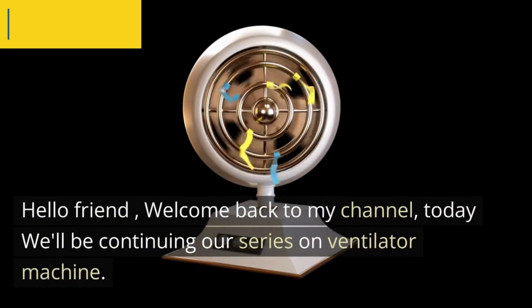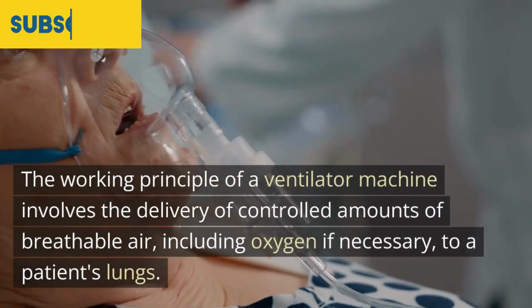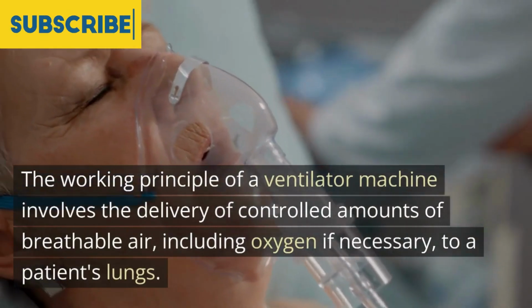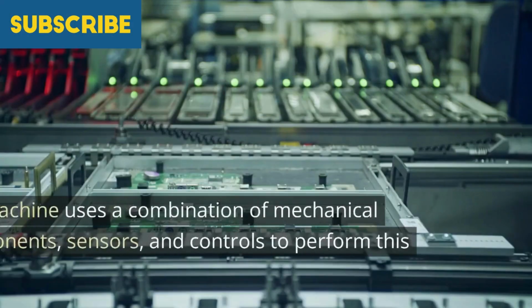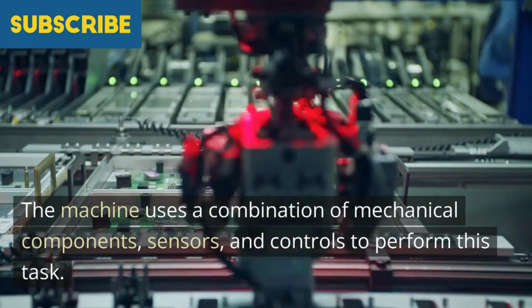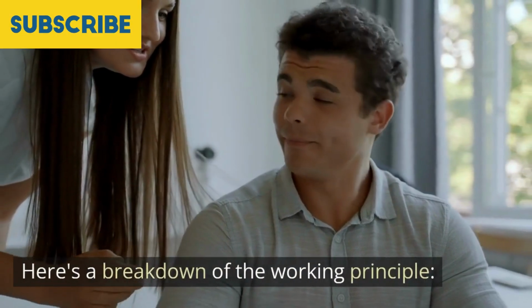Today we'll be continuing our series on ventilator machines. The working principle of a ventilator machine involves the delivery of controlled amounts of breathable air, including oxygen if necessary, to a patient's lungs. The machine uses a combination of mechanical components, sensors, and controls to perform this task. Here's a breakdown of the working principle.